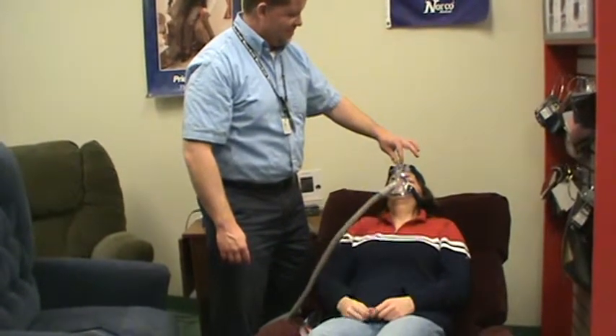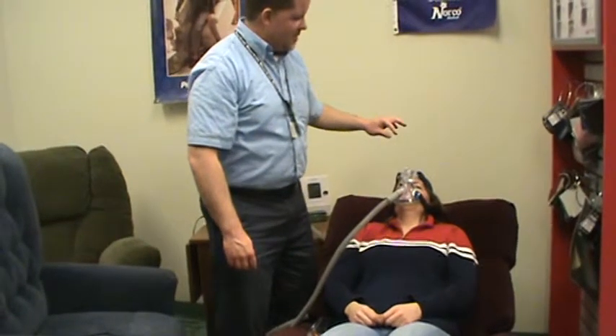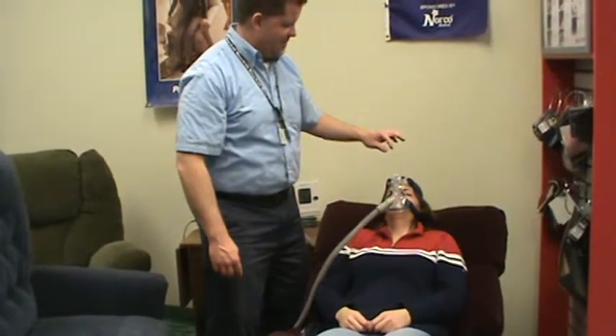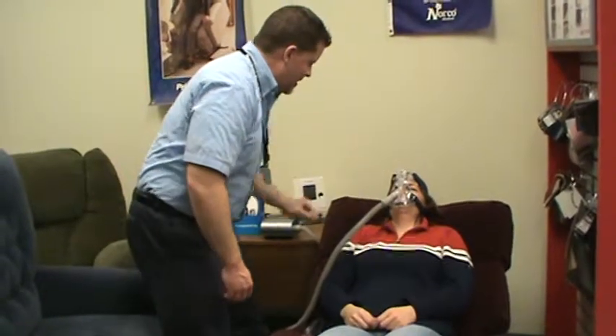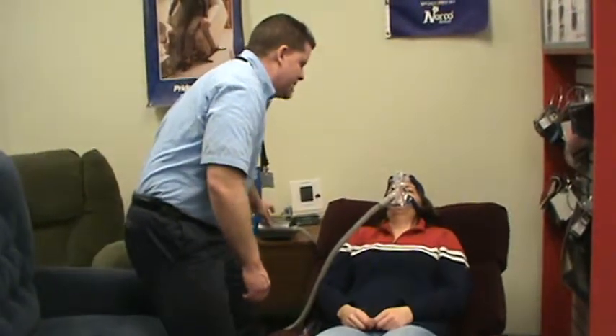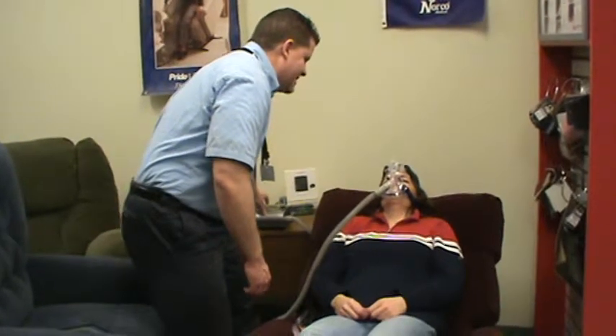Is that comfortable there? Thumbs up or thumbs down? Thumbs up. Very good. I'm going to stop the pressure now and remove the mask.